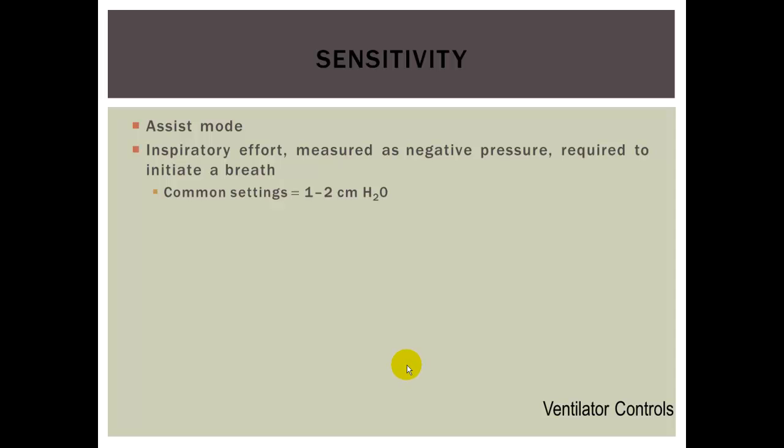Sensitivity. Assist mode, whenever we're in that. Inspiratory effort is measured as a negative pressure, so whenever the patient initiates, the actual effort causes a negative pressure in the ventilatory circuit, and this is going to initiate the breath. And the common setting on this, whenever we're looking at sensitivity, is 1 to 2 centimeters of water.